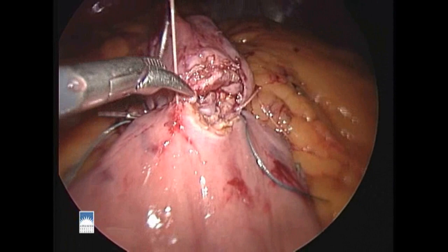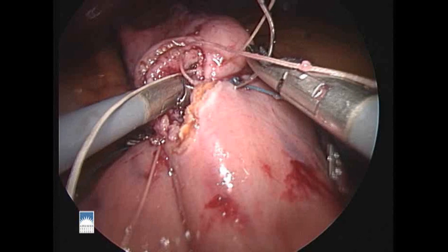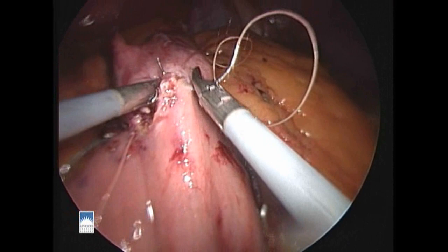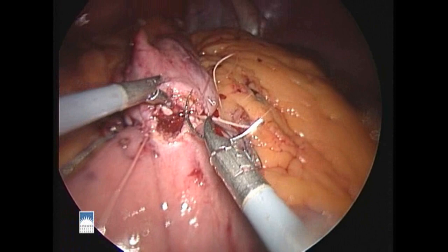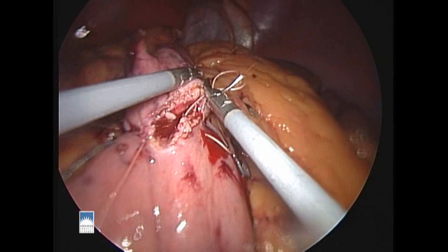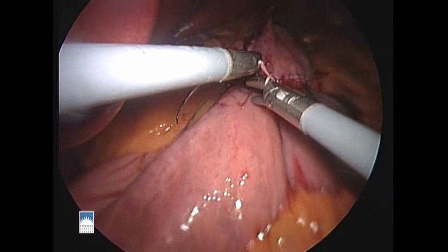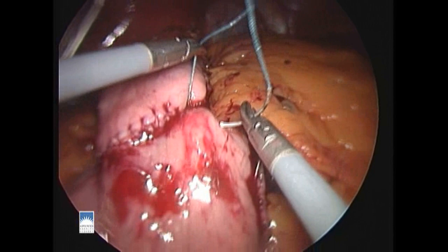Now we're just about finished with the back wall of our inner layer of suture. We'll start now with another suture for the anterior wall of our inner layer. The two strands of white suture will be tied to each other at the far end and at the near end of the new anastomosis. Once the anterior wall meets the posterior wall, the two strands are tied to each other, then cut, and the inner layer of the anastomosis is finished.